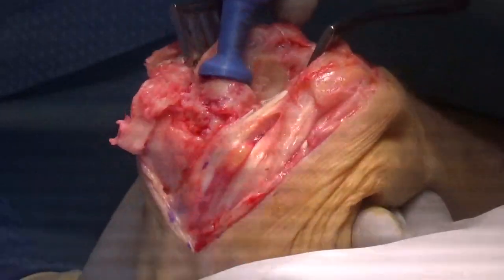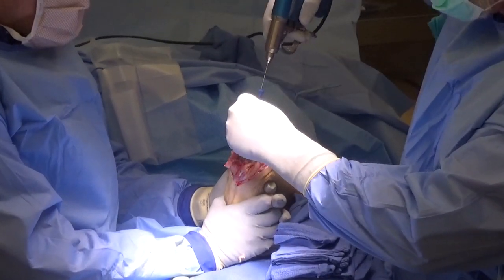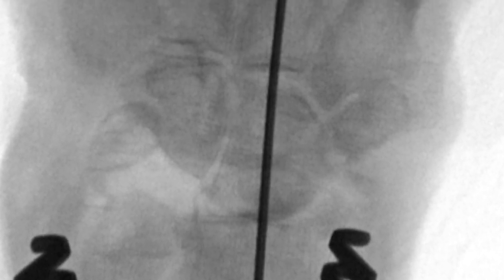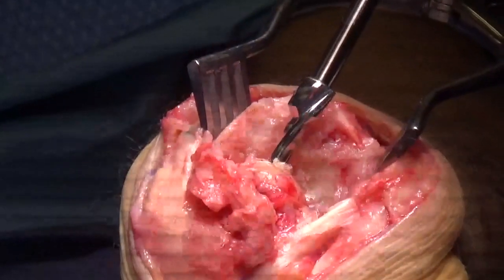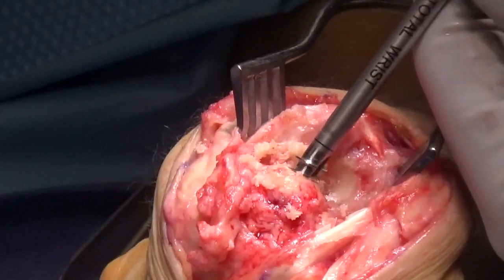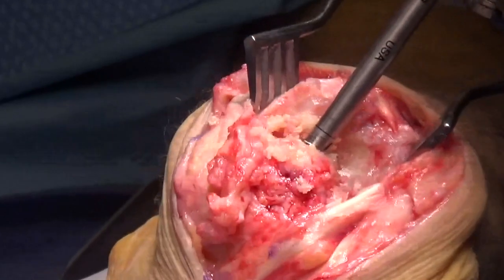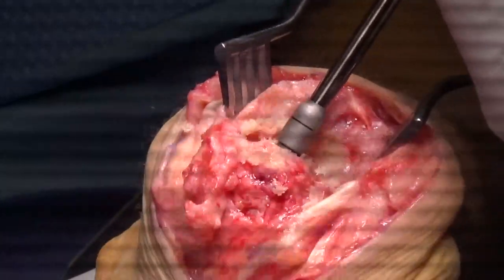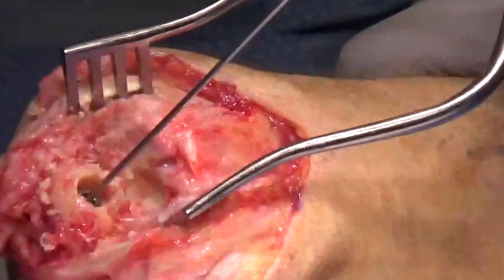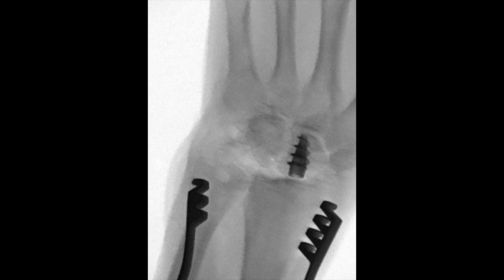Utilizing the carpal guide, a guide wire is placed down the central axis of the capitate. This is confirmed under fluoroscopy to be an ideal position. It is then reamed with a carpal twist drill and then tapped right to the level of the laser line. At that point, the taper post is inserted over the guide wire to the level of the laser line. The position of the screw is confirmed under fluoroscopy, well centered in the capitate.